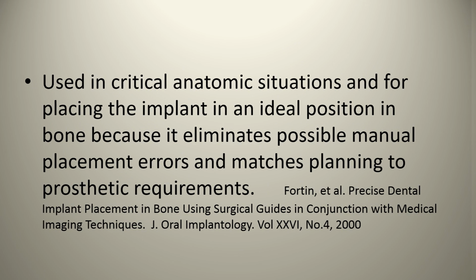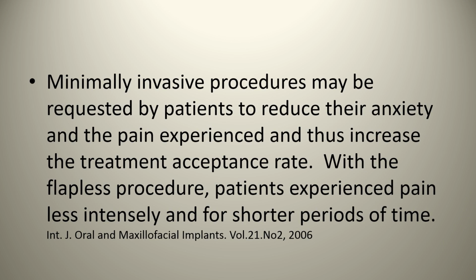So going a little bit more recently, 2006, when we started talking about flapless procedures, one of the things that cone beam CT did offer was minimally invasive procedures, which may be requested by patients to reduce their anxiety and the pain experienced, the morbidity associated with implant surgery, and thus increased treatment acceptance rate. With the flapless procedure, patients experienced pain of less intensity and for shorter periods of time. There's also the issue that with flapless, you're reducing the lack of blood supply to the periosteum, and as such, you're no longer compromising the blood supply to bone.